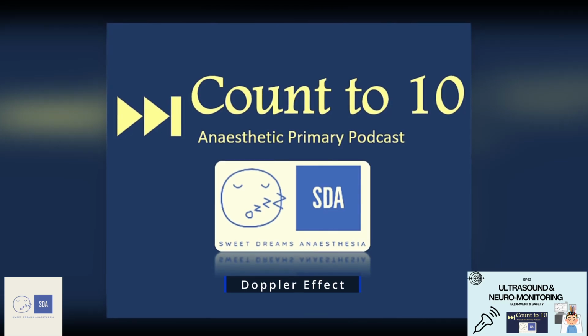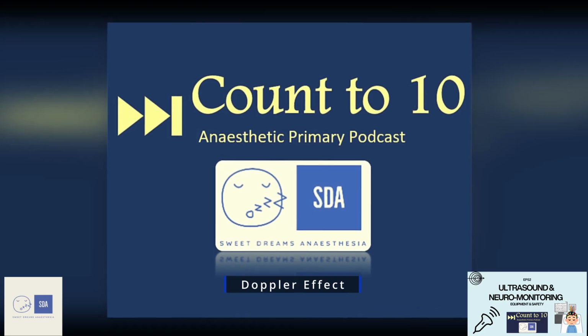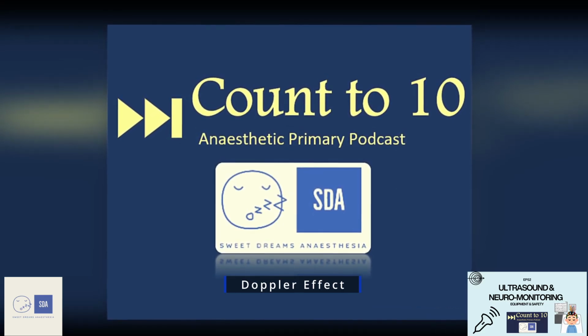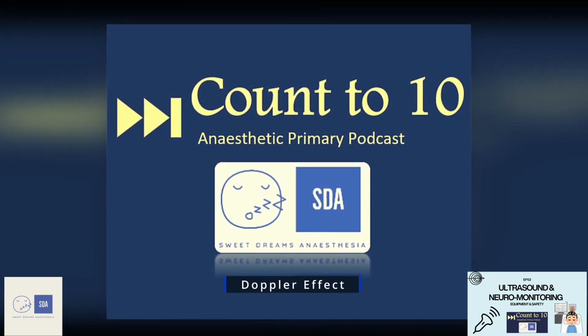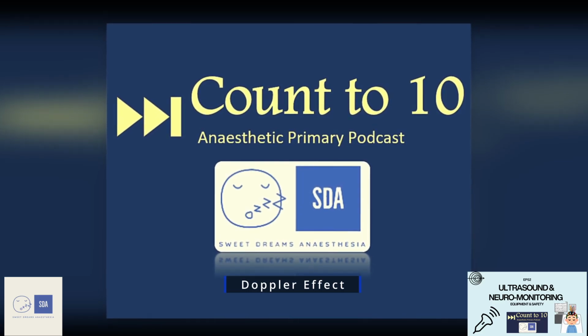And because there's this range from 0 degrees to 90 degrees, depending on what text you read, they say that the acceptable angle of incidence is sometimes within 30 degrees or 60 degrees. And we'll talk a bit more about this Doppler shift equation when we review one of the specific past SAQs that looks at measuring cardiac output.